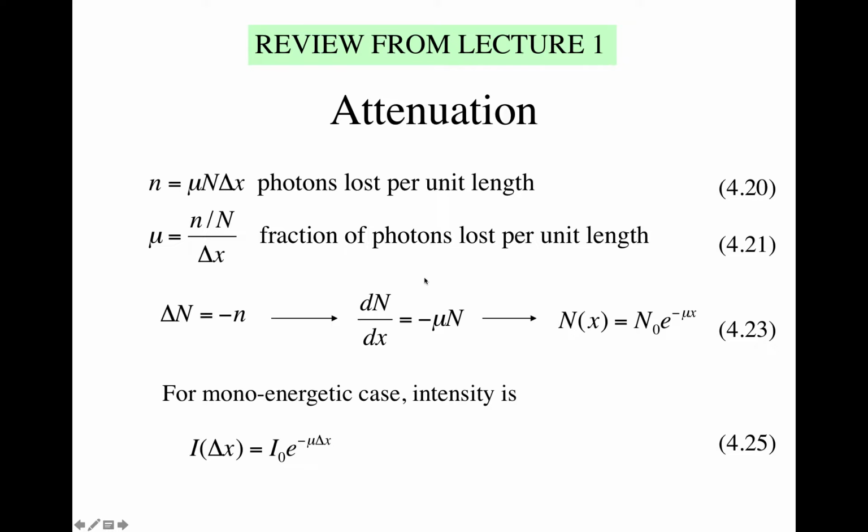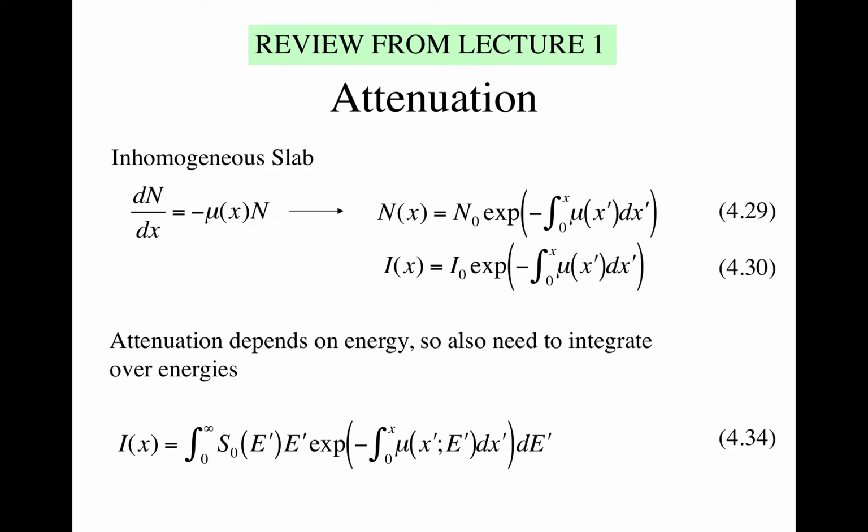And it's a simple linear first order equation, just like if you had a hot cup of tea, right, and you put it down, the rate of change of the temperature of that cup of tea is proportional to the temperature, right? So when it's really hot, it cools down faster than when it's close to ambient temperature, when it cools down slower. That's sort of the first equation that you run across in differential equations, right? And this is its solution. You'll see this equation in this form many different ways. And it often comes out called Beer's law in X-ray attenuation.